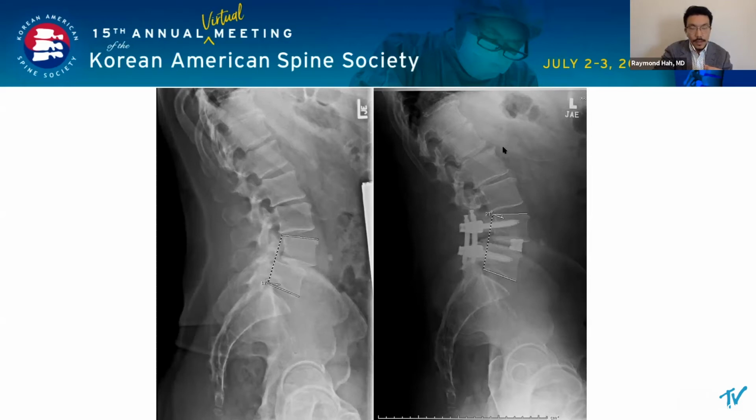PI is actually pretty reasonable. His PI is, I would say, in the mid range, but he has focal kyphosis through the L4-5 disc space. And actually, there's some unrecognized compensatory mechanisms. You can see that he's fish mouthing at the 3 disc spaces above. He's a little retrolisthesed.